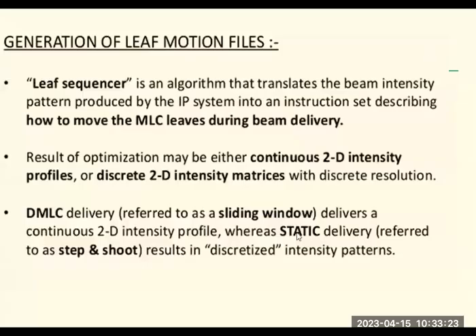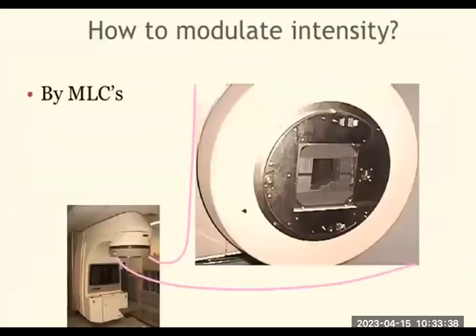So in the video we have seen that the gantry rotates around the patient, and you can find that the collimator is programmed so that the intensity beam can be varied with respect to the size and structure of the tumor. So that is what the modulated intensity is. You can see that this is zoomed.